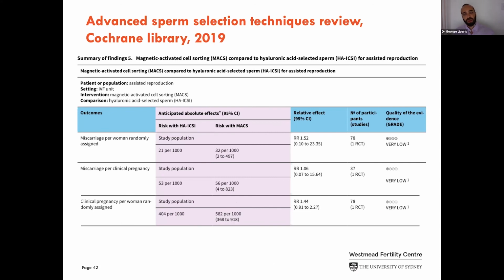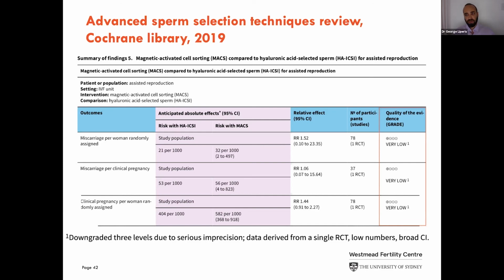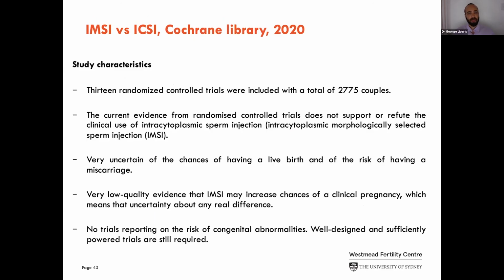When they compared the MACS against the hyaluronic acid, there were no differences. And once again, the quality of the evidence was very low.